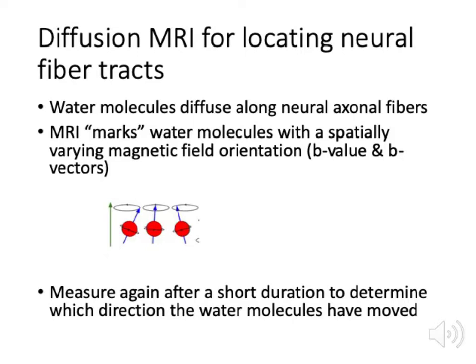And when they resonate, they in turn generate a magnetic field in this direction shown in the blue arrow, which can be detected by circuitry. So our sensitive MRI electronics are able to detect both any variations in the resonant frequency of the water molecules, as well as the directionality of the generated magnetic field of each individual or groups of water molecules.